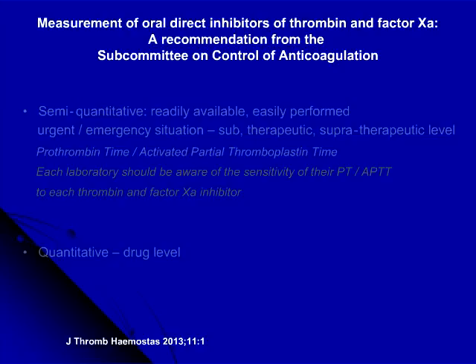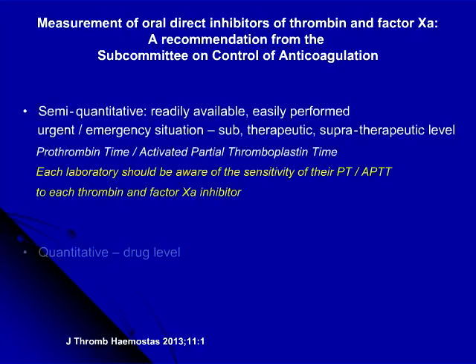Now, the SSC, the Subcommittee on Control of Anticoagulation, has produced a recommendation and recognises that some tests will be semi-quantitative. These are the readily available, easily performed tests, which might indicate at any moment in time whether a patient is subtherapeutic, therapeutic or supratherapeutic in terms of the anticoagulant effect. And alternatively, there'll be quantitative tests which can be used to measure the drug level. And I'd just like to share two simple scenarios in relation to the use of the semi-quantitative tests and illustrate this need again for education of non-expert healthcare staff.